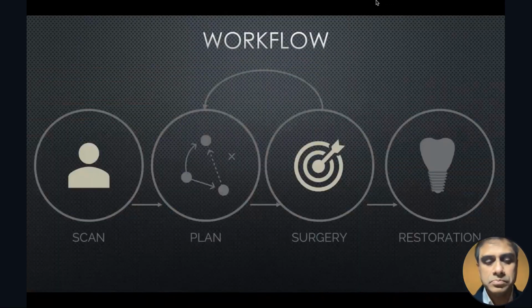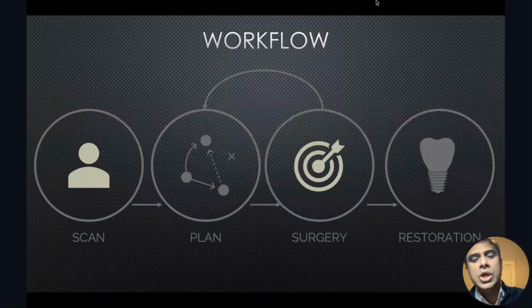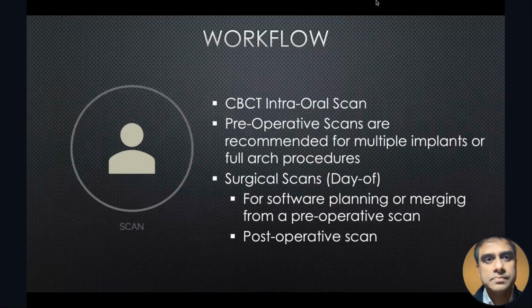Next slide, please. So the workflow is what we talked about. First, obviously, you have to get the CBCT, you have to transfer the DICOM into the robotic planning software, and then you go into surgery and restoration. Next slide, please. So in the workflow, we took the CBCT, the pre-op scan.